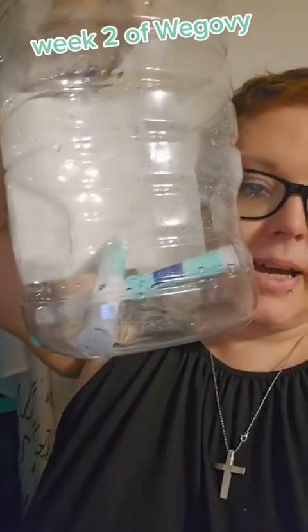They say count to 10 after that, because if you pull away too soon, you can actually lose the medicine. But I technically count to 25. So after I'm done, I put the cap back on it, and then I put it into this little plastic container. And that's it.